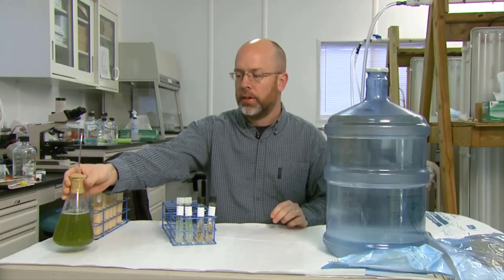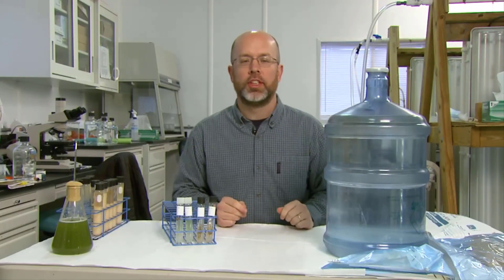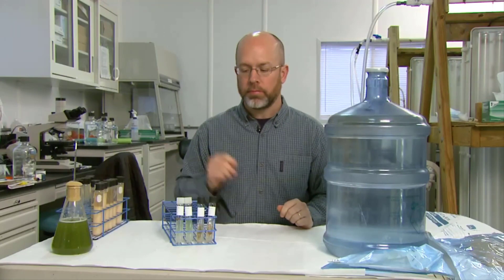In this case, we're just using a five gallon water container that you would get from a spring water company or something like that. You can use any five gallon system that you can sterilize. As long as it's sterile, you're good to go.